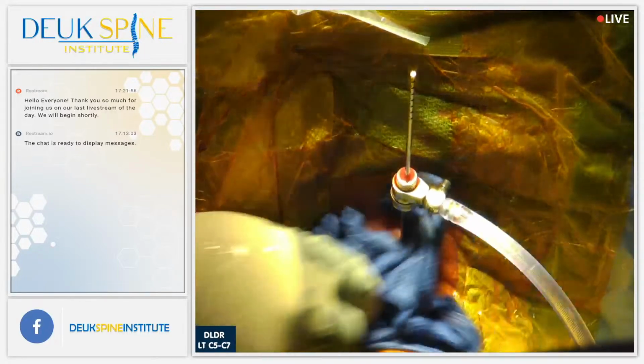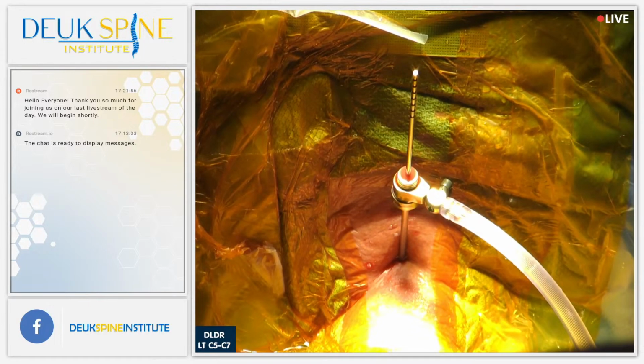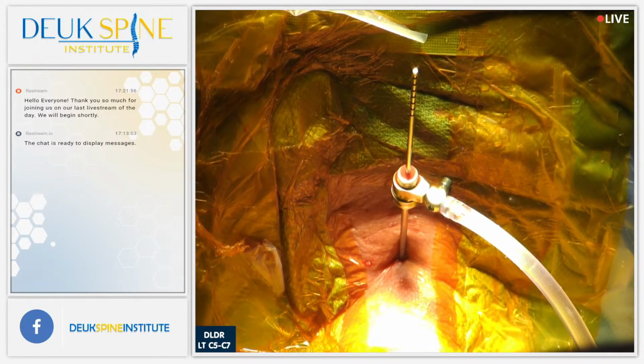All right, let's bring in the fluoroscope. The next level should be easier to see on the X-ray machine.